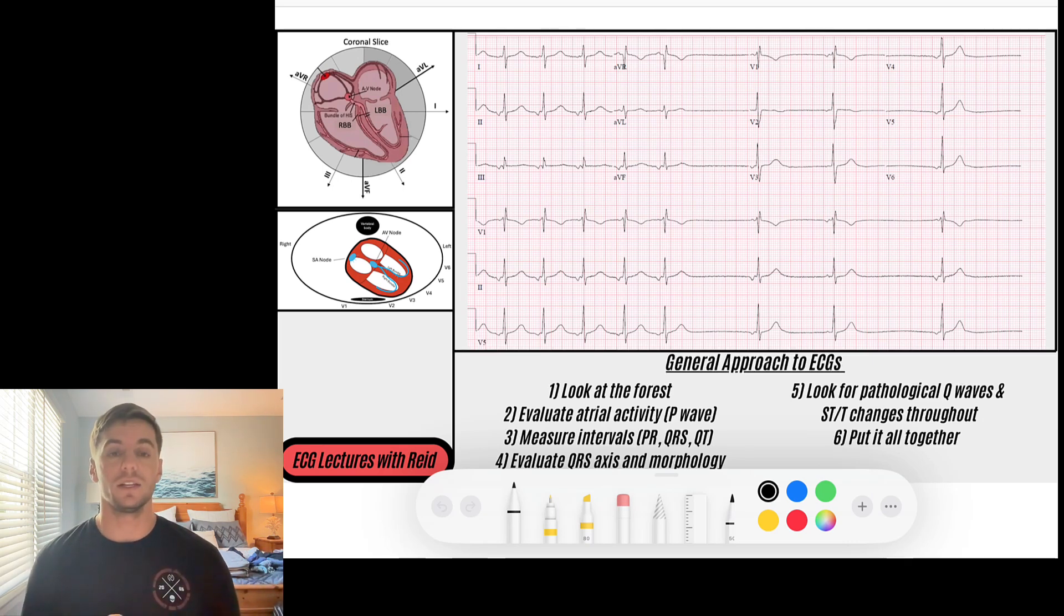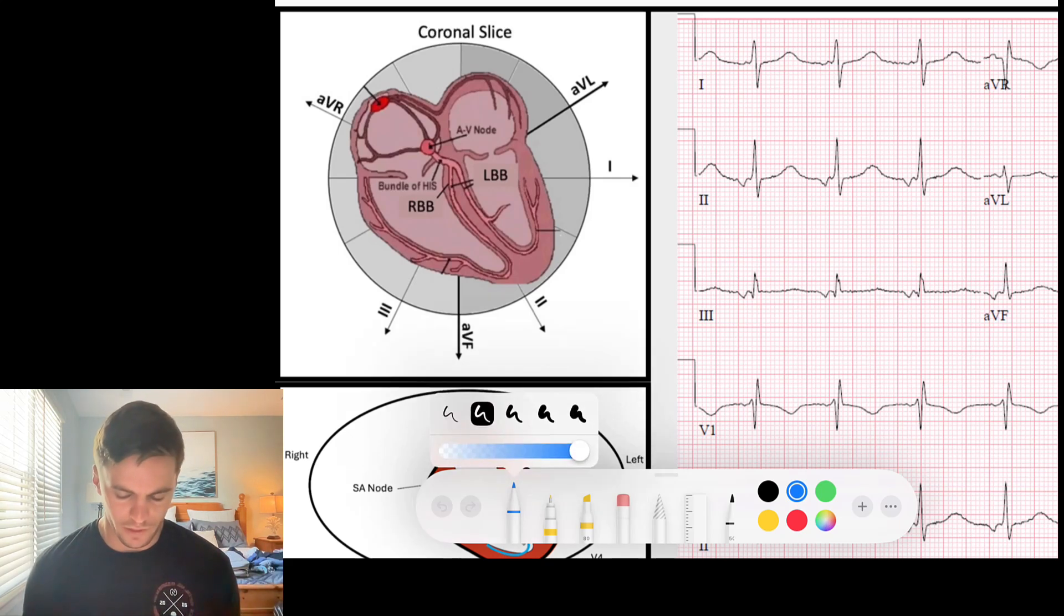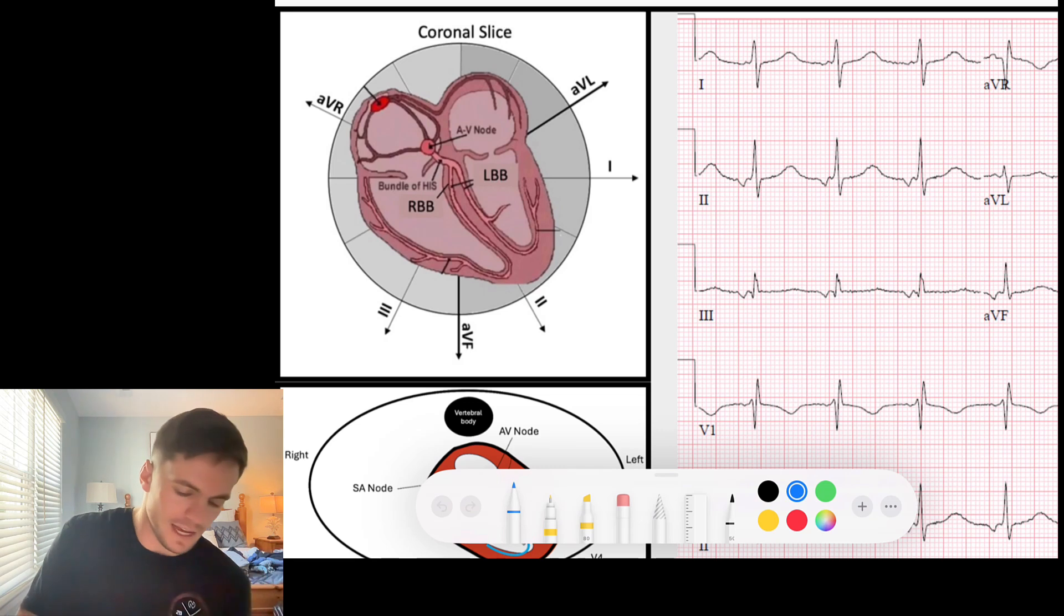So let's jump into it. Remember that the atria typically depolarizes—let's just review the typical depolarizing waveform within the atria. Typical depolarization occurs from the SA node, and the SA node sits high in the right atrium here, and the SA node fires off.